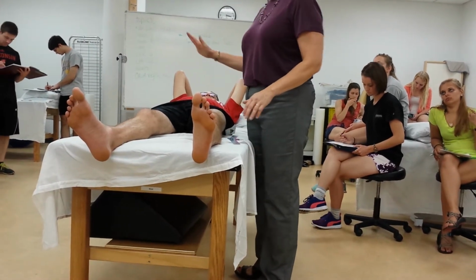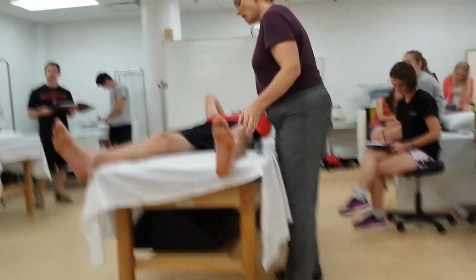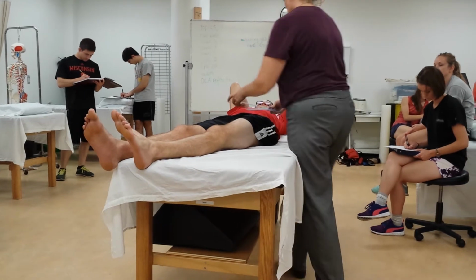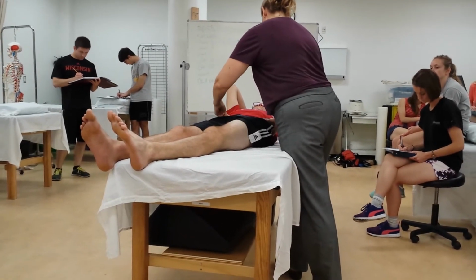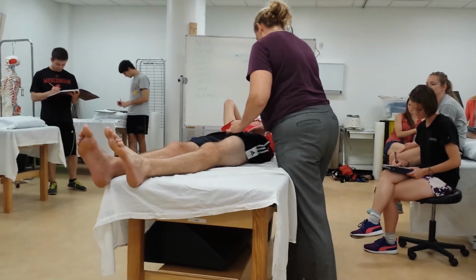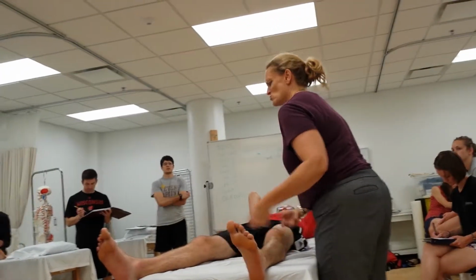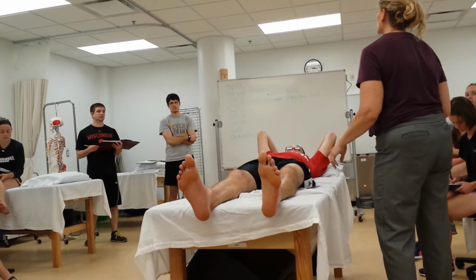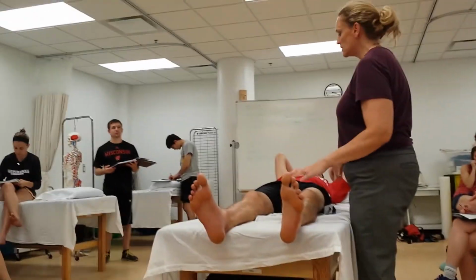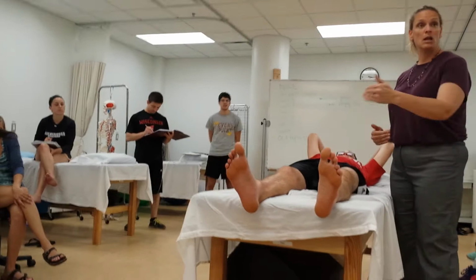For adduction, the goniometer placement is going to be exactly the same. You need to move the other leg out of the way. Now I'm going to be monitoring his pelvis. There you go. Goniometer. And 0 to 19 degrees. You're really kind of normal. The norm for adduction is 20 to 30 degrees. We're not bringing the leg up and over like we are for the shoulder, and so we do have norms for adduction. So in supine we've got flexion, adduction, and abduction.